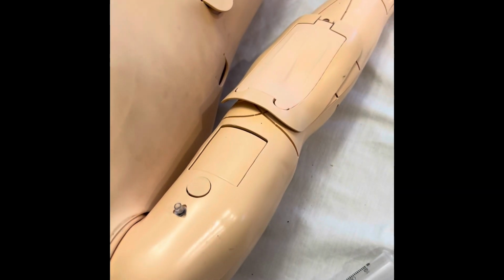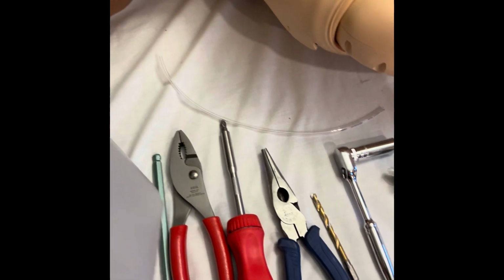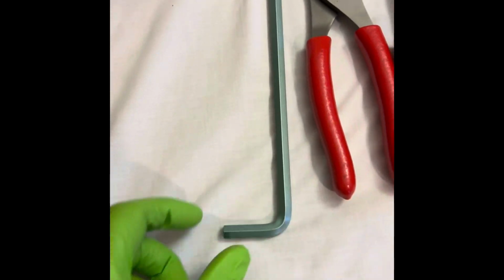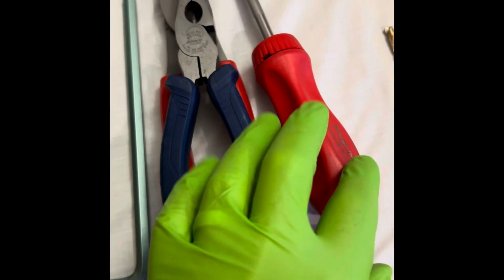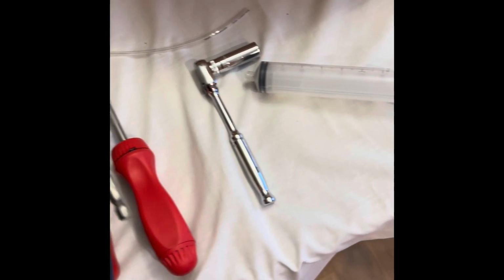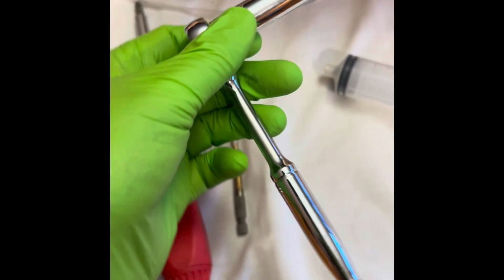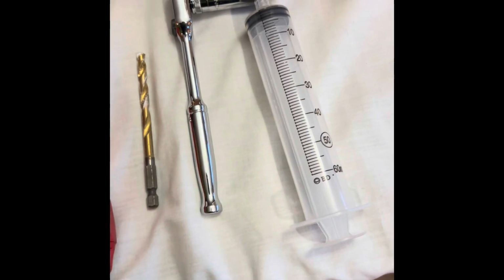You can see the skin is already off the mannequin here, and he needs some work, so ignore any other issues that you might see. For today, you're going to need distilled water, an 8mm Allen wrench, or the one that came with the mannequin, a pair of pliers, regular or needle nose, a number 2 Phillips screwdriver. I have the multi-tool here. And then a drill bit. The size is, barely see it, 7/32. And then a 10mm, 11mm wrench, ratchet, whatever it might be, with a deep socket, and then a syringe, pretty much any size.